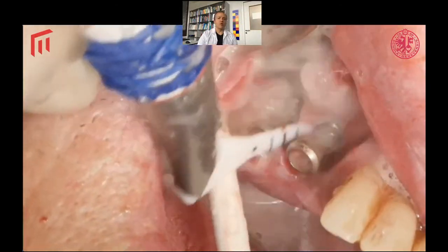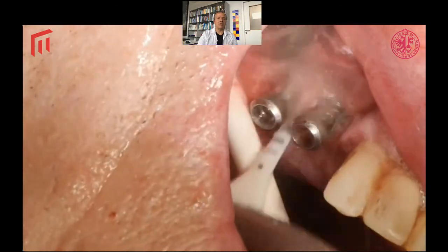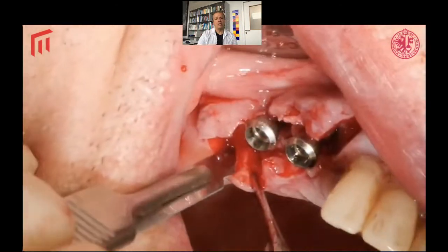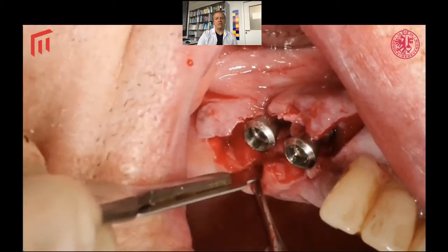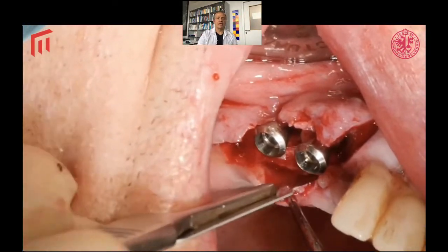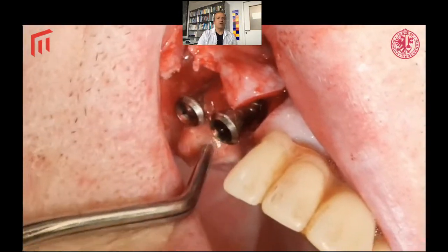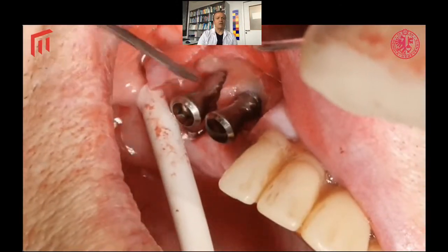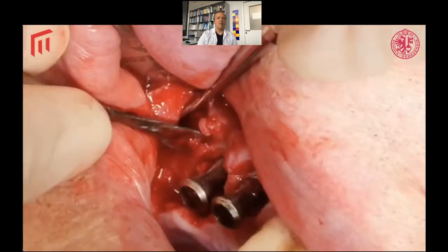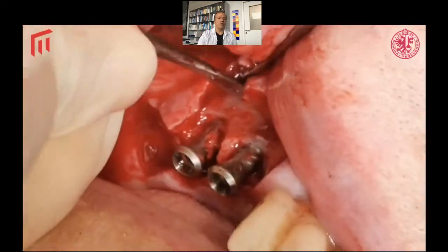removed, and then we use an air polishing device to decontaminate the intrabony component where access is difficult. Then clean the remnants of the air polishing powder with sterile saline, and thin the palatal tissue a little bit to allow a better adaptation on the palatal aspect. Again, decontamination, the next step with hydrogen peroxide 3%, cleaning with sterile saline again, and then harvesting a little bit of autogenous bone from the neighboring area with the raspatorium.